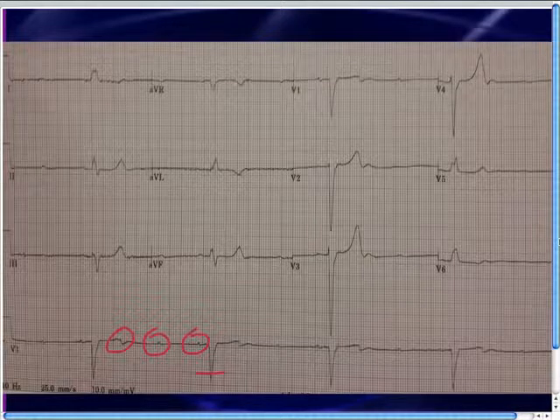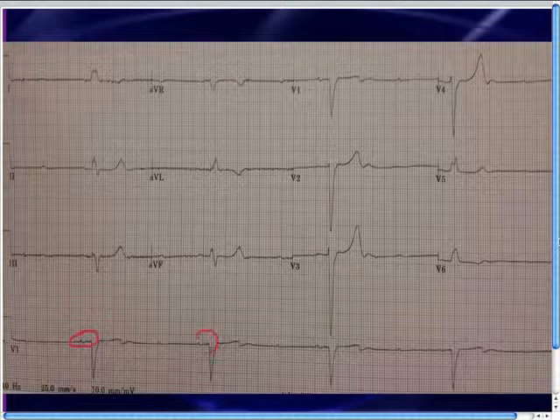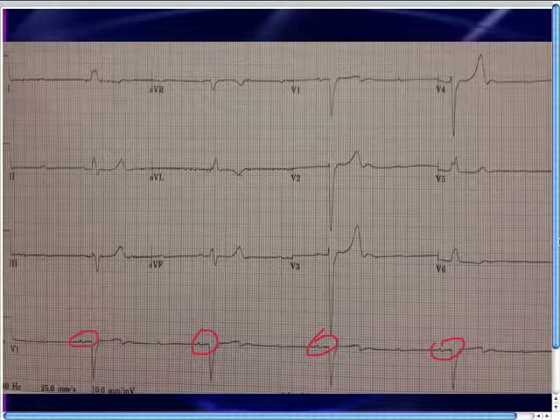Well, it's very simple. Whenever you're debating Mobitz 1, Mobitz 2, or AV dissociation, the answer lies in the PR interval. So just take a look at all of the PR intervals. There's one, there's one, there's one, and ask yourself, what are they doing? If it's Mobitz 1, the PR will be increasing before the drop. If it's Mobitz 2, the PR stays constant. And if it's AV dissociation or complete heart block, the PR will be randomly changing, increasing in some areas, then decreasing, and then really big and really small, and just kind of all over the map.